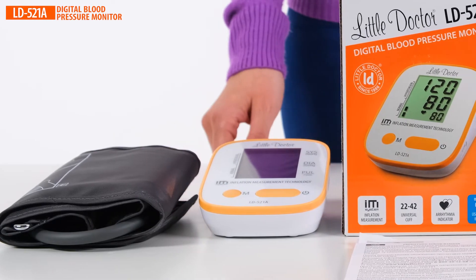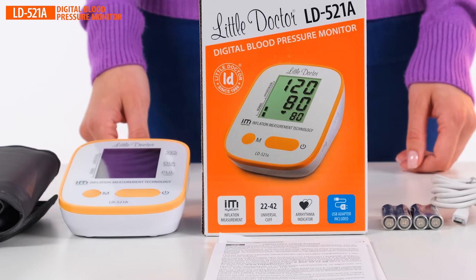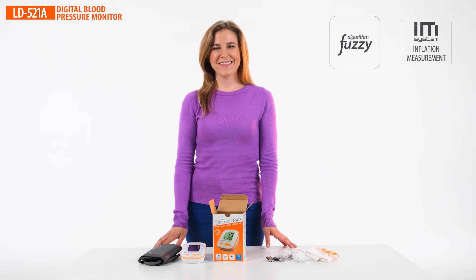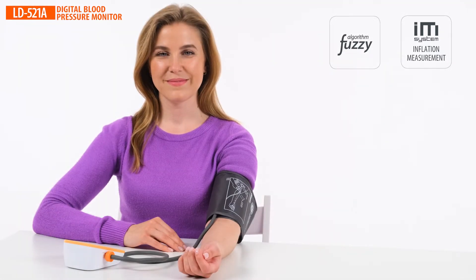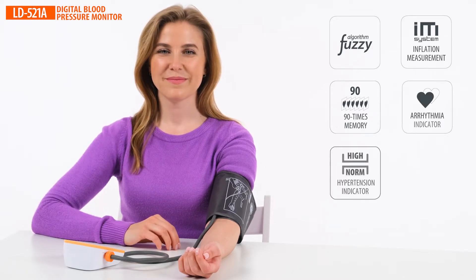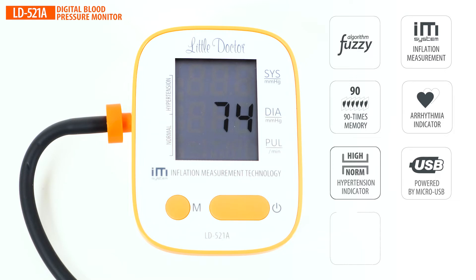Little Doctor presents the LD521A, a state-of-the-art automatic digital blood pressure monitor. Key features include fuzzy smart measurement logic, a new inflation measurement sequence where blood pressure and pulse are measured during cuff inflation, memory for 90 measurements, an average value for the last three measurements, an arrhythmia indicator, a hypertension indicator, a micro-USB port for power supply, a universal cuff with a metal ring for self-measurements, and a certified medical grade power adapter.